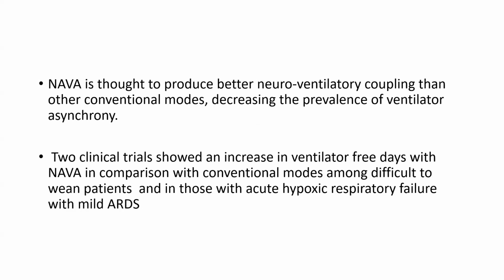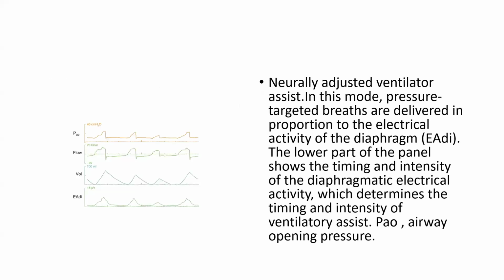NAVA is thought to produce better neuroventilatory coupling than other conventional modes, decreasing the prevalence of ventilator asynchrony. Two clinical trials showed an increase in ventilator free days with NAVA in comparison to the conventional mode among difficult to wean patients and in those with acute hypoxic respiratory failure and mild ARDS.